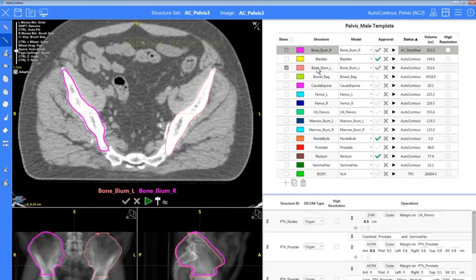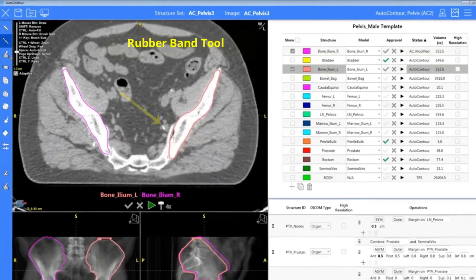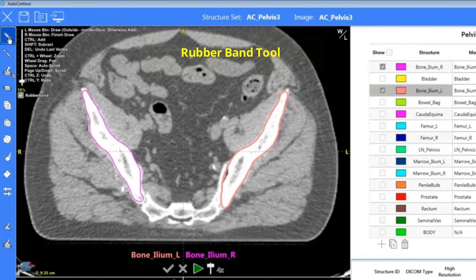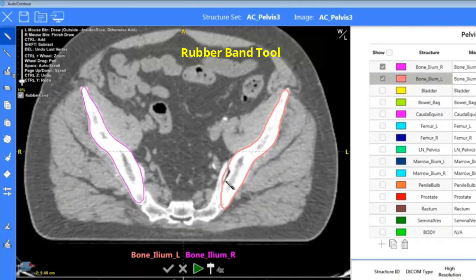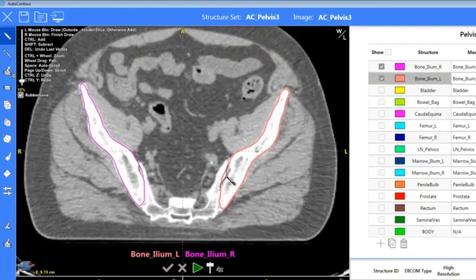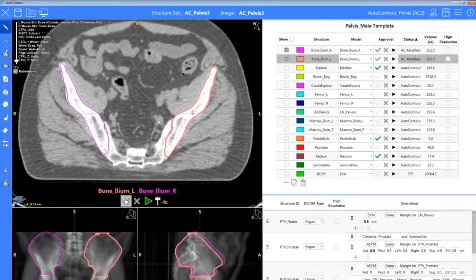For my left ilium I may just want to tighten up the contour a bit, so I'm going to use the pencil and rubber band tool. I'm able to just pull in that contour making small adjustments, and once I'm happy I'll approve that structure and it'll take us to the next.